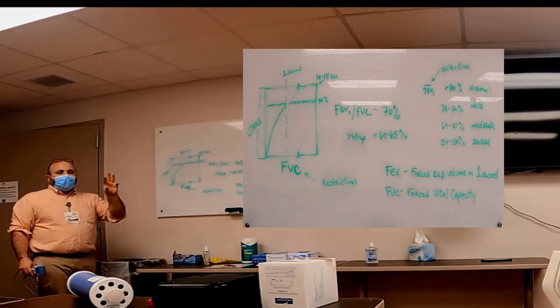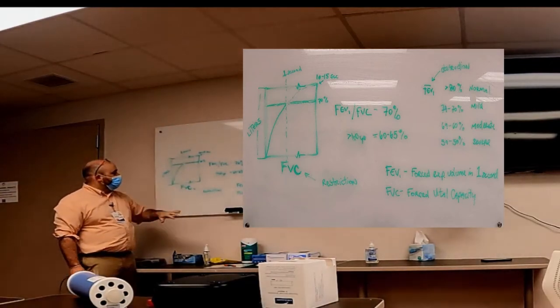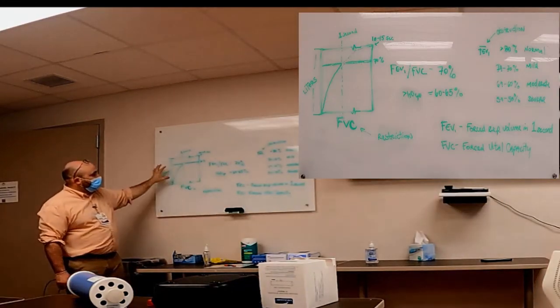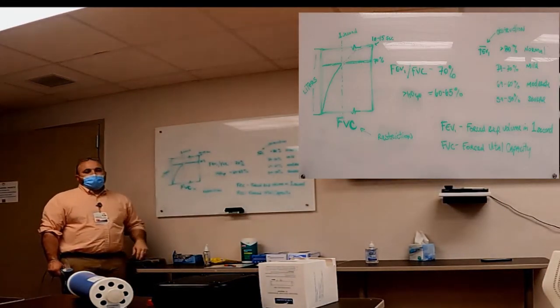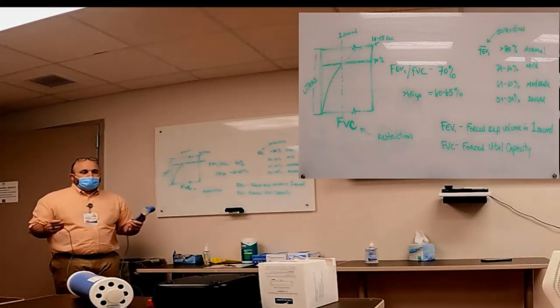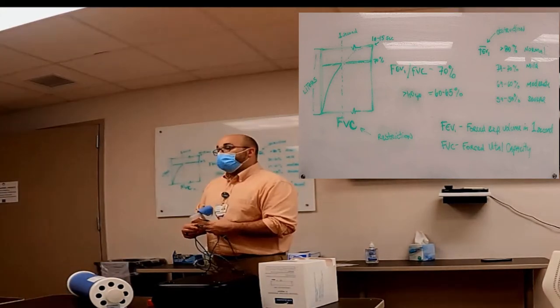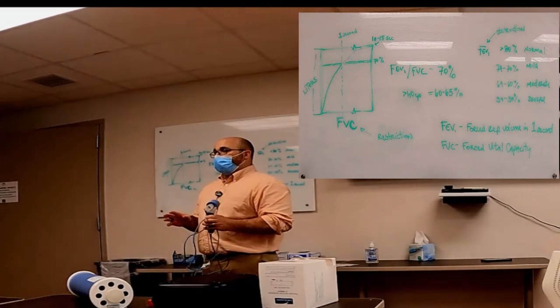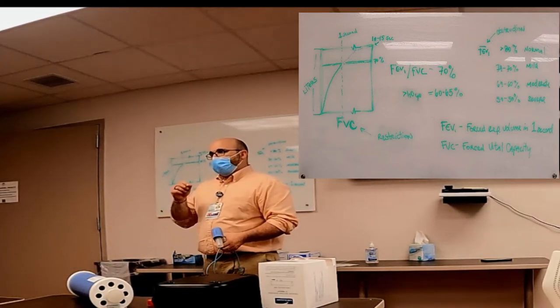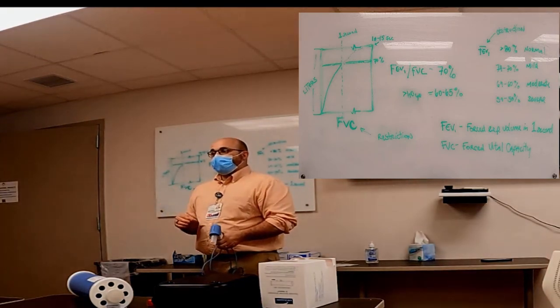As a review, we look at three different things. FEV1, forced expiratory volume in the first second, tells us about obstruction. FVC, which is the full capacity, and the ratio, and all that stuff is given to you super easy. And we were going through the procedure for doing the breath. It's going to be a maximum breath in, and I'll show you. And since you came in a little late, I'll have you do it on me downstairs, just so you can coach me. It's all about coaching and knowing and making a reproducible test.